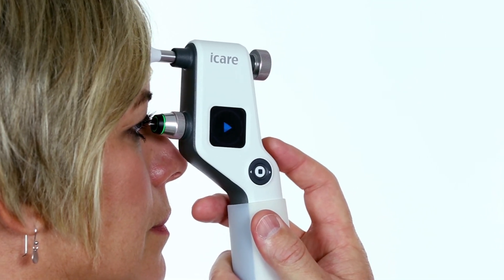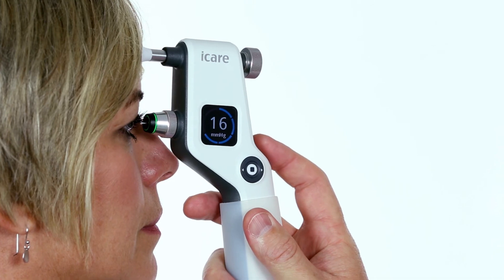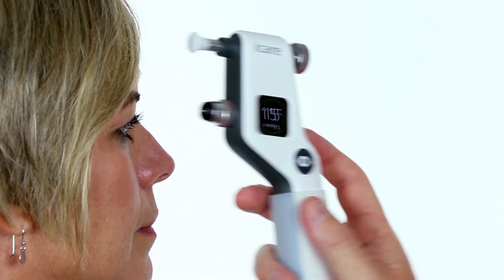To perform individual measurements, press the measure button lightly 6 separate times or until you hear a long beep.